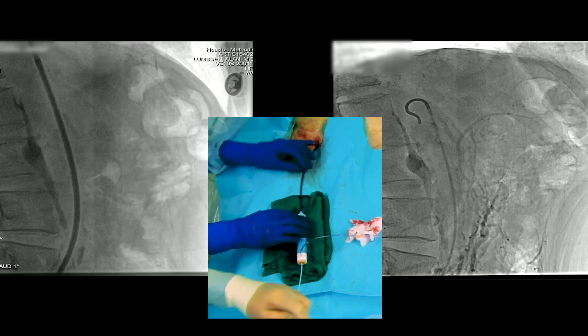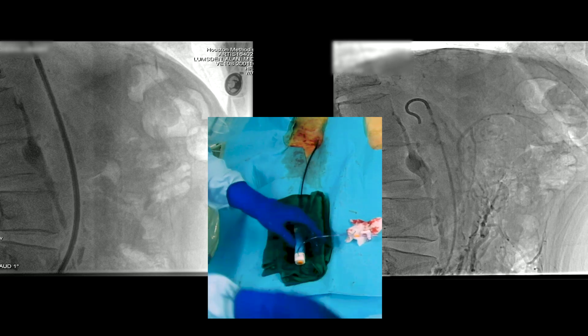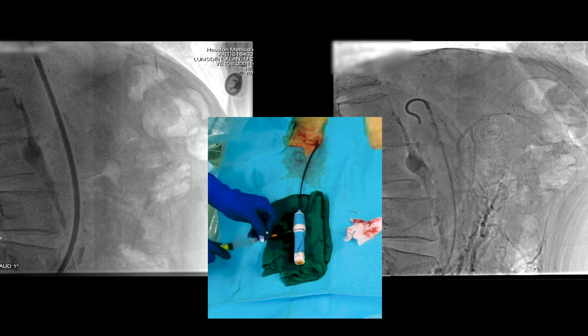This is an Aptus sheath which we inserted. Tips are always put much higher than you think — it really shortens up as you create the curve on the end of the Aptus sheath.